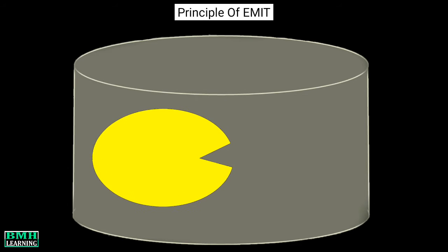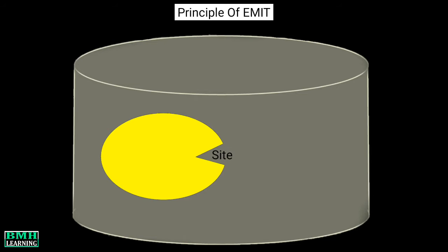So, enzyme is a protein that has a catalytic site called active site. Now, the enzyme shows its activity when a specific chemical binds to this particular location present on the enzyme. The chemical that binds to this particular site is nothing but the substrate. So in this immunoassay, we use an enzyme substrate system such that when the enzyme and substrate bind to each other, the enzyme brings about a change in color of the substrate.